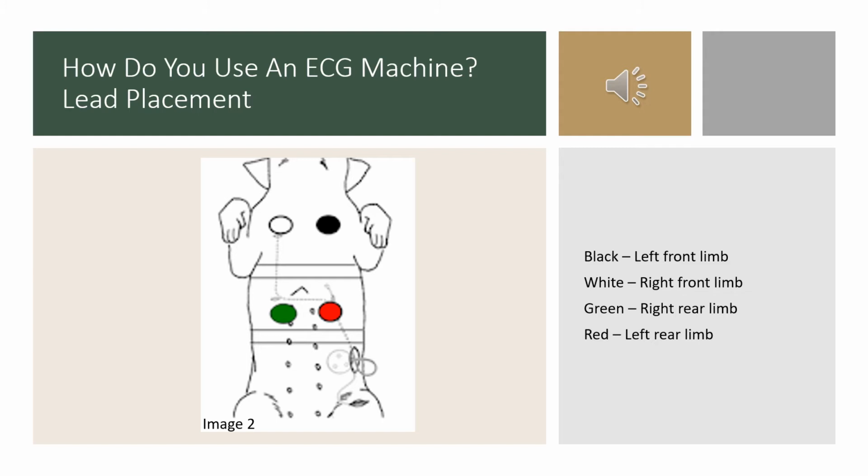Using a fun way to remember the placement is helpful when initially learning to place the leads, or when you're in a hurry. The ones I personally use are white rhymes with right, and also clouds are over the grass and smoke is over the fire.